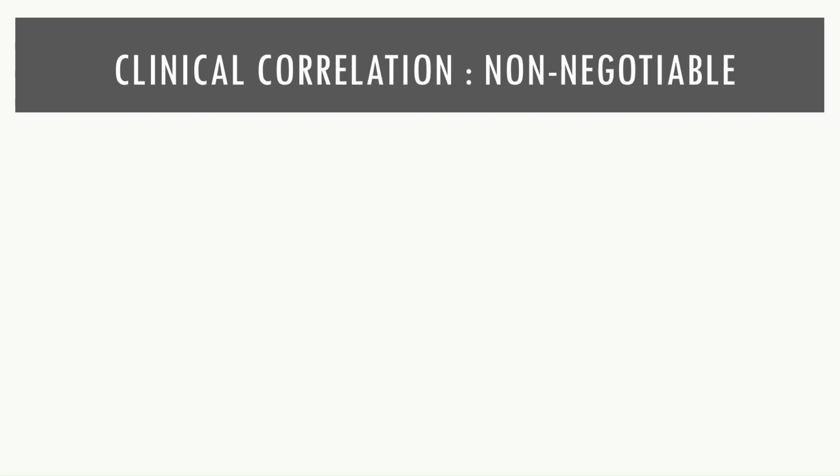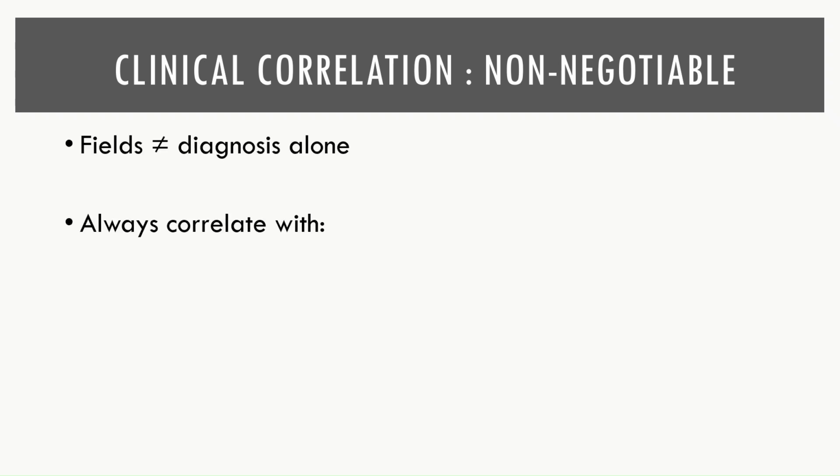Clinical correlation is non-negotiable in perimetry. Field is not equal to diagnosis. Always correlate with disc, OCT, and symptoms.